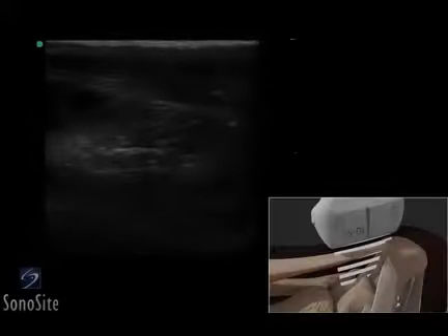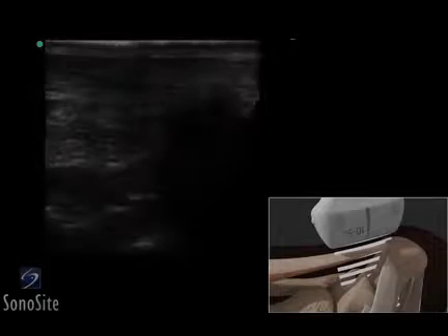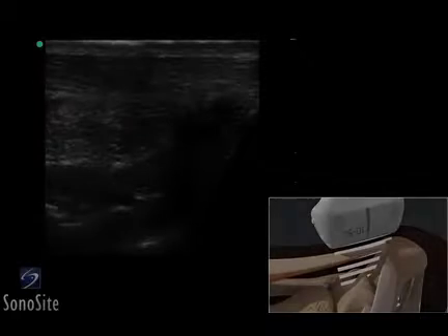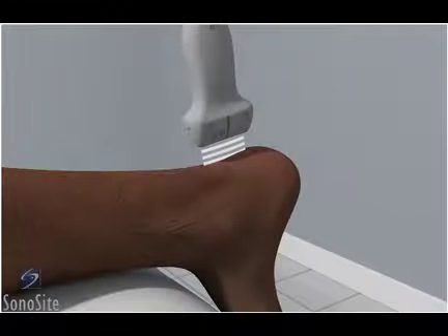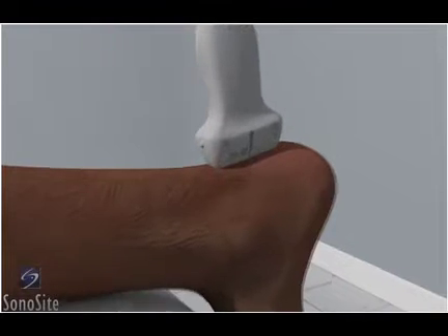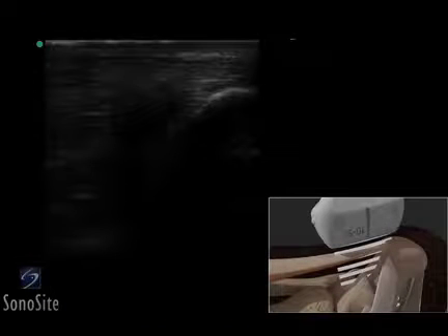A linear array transducer with a musculoskeletal exam type is used to perform an ultrasound-guided injection of the Achilles tendon. The patient is in a prone position, with the foot extending beyond the examining table in a neutral position. The transducer is placed longitudinally over the Achilles tendon, just proximal to the calcaneus, with the orientation marker directed to the patient's head.